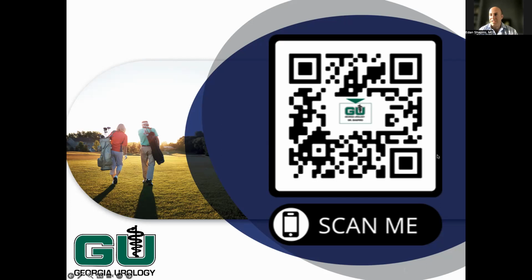So the first question is, what happens after the procedure? Does the prostate continue to grow? And the answer is it does continue to grow. So if you had a procedure, whether it's a UroLift or a TURP surgery, anything where you're not actually removing the entire prostate, which is only done in the setting of cancer, the prostate continues to grow. So the most common reason why you might need a retreatment would be regrowth of the prostate or incompletely treated prostate initially.